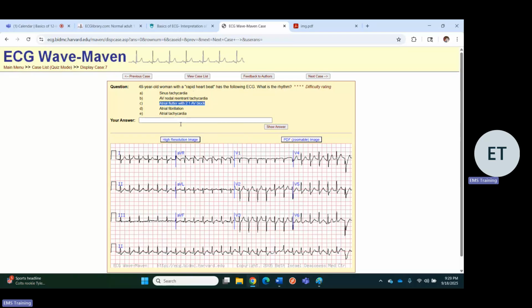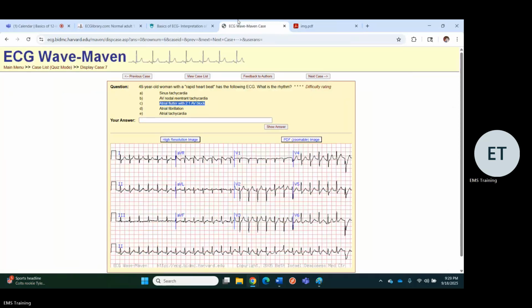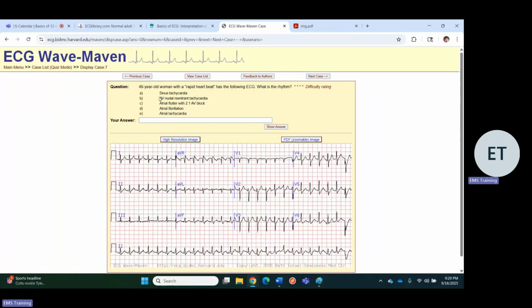Tough. Atrial tachycardia, honestly, I don't really see that enough to be able to intelligently talk about it, but I don't see any atrial activity. And if I do, it's post-QRS complex, like there. So that doesn't really fit with atrial tachycardia. That definitely fits with a flutter, because that could be. Oh no, usually the flutter wave is more buried in it than that. Okay, well, it's that or it's that.